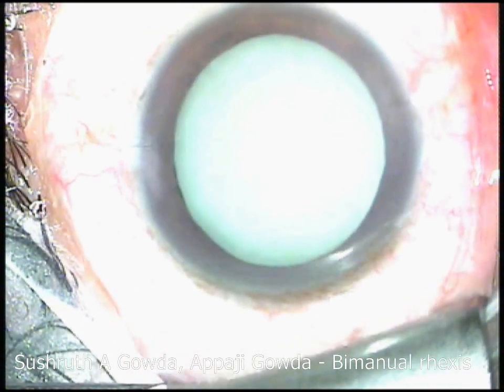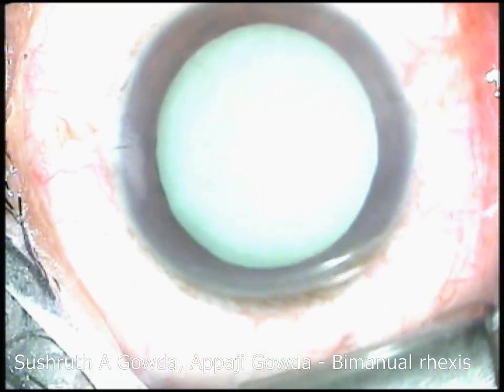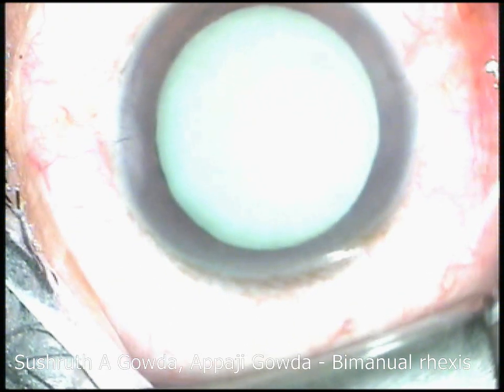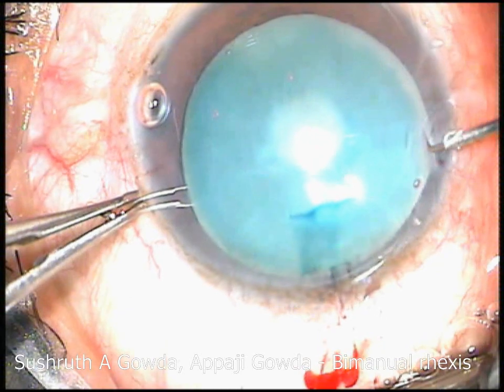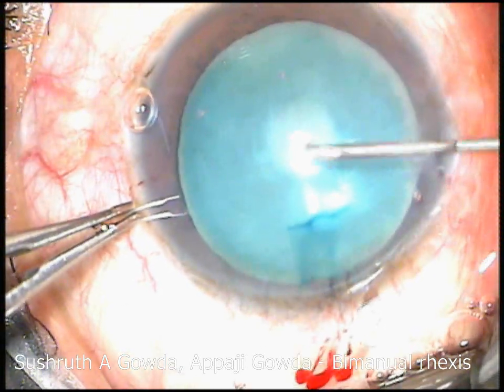Greetings everyone. I am Dr. Sushrut and I am presenting a Rhexis-making situation in a mature cataract and how I overcame that situation using the bimanual technique in this video.